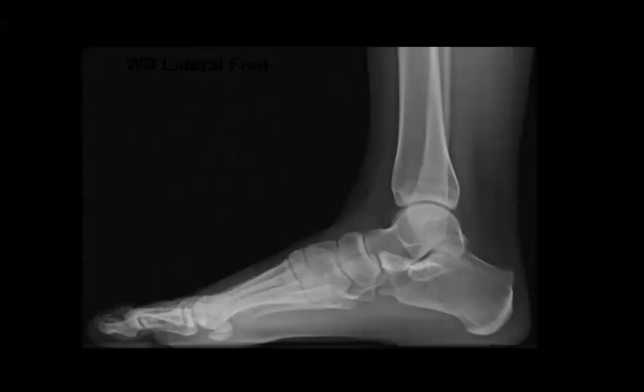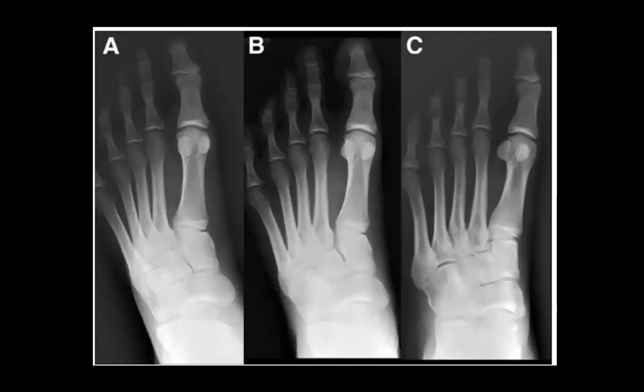It's usually 90 degrees. Sometimes people have a little bit of recurvatum, and it may be a little bit of bowing, but it needs to be loaded in order to be able to evaluate angles. If it's a non-weight bearing image, you can't tell the angles.